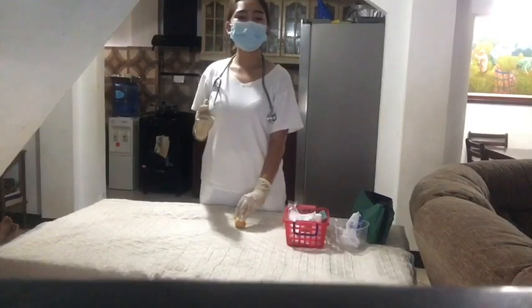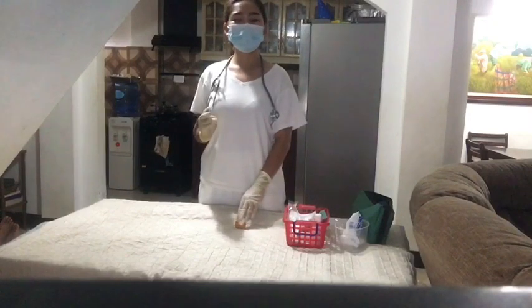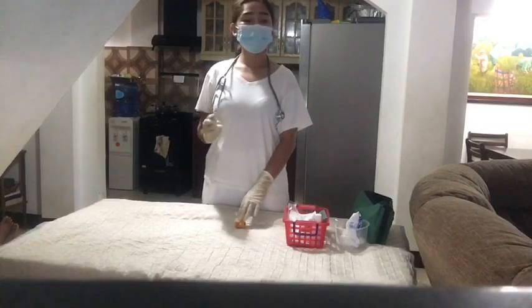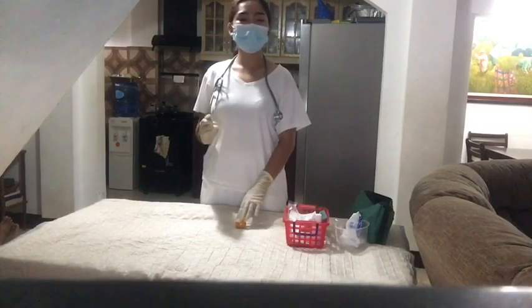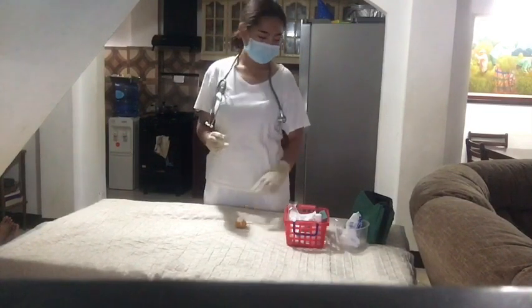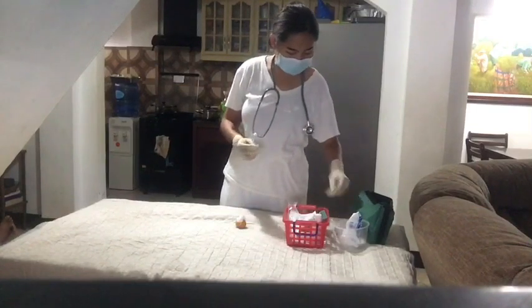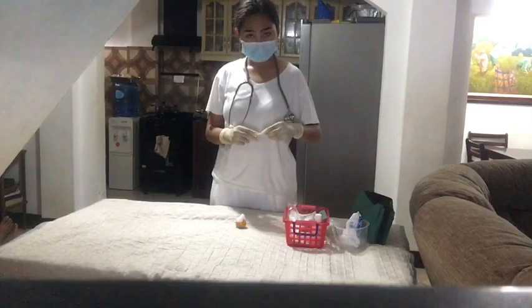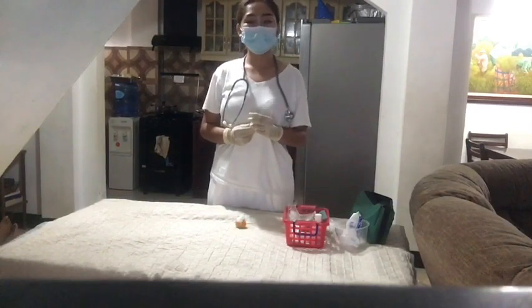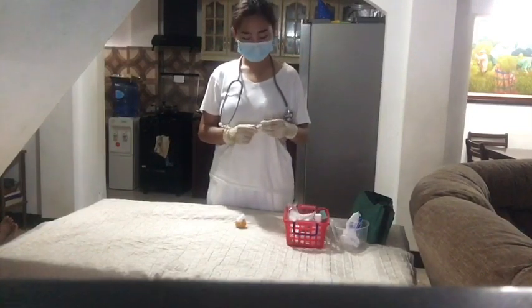We will now assist the client to a comfortable position. This is to provide the patient's comfort. And after which, discard the uncapped needle and syringe in a disposable needle container. So I will get the cover of the needle and dispose it properly. It is because most accidental needle sticks occur while recapping needles. This prevents injury.